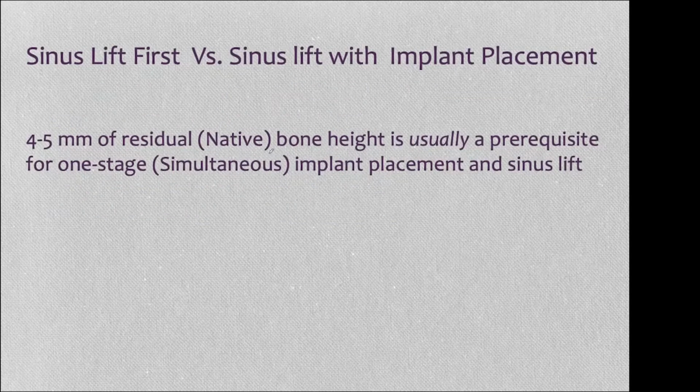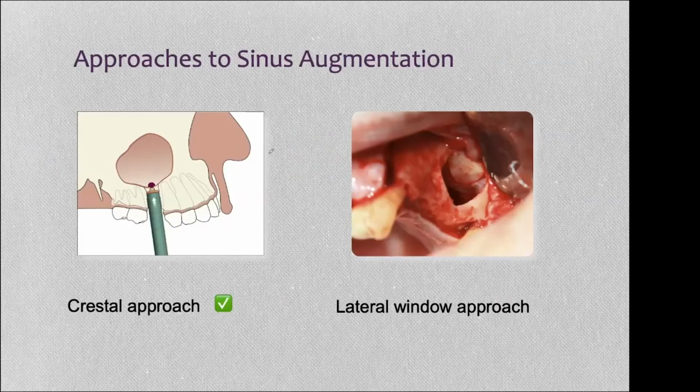So when do you do a sinus lift separately first, i.e. a lateral lift? And when do you do both? Now, if you use Bicon ultra short implants and you've been to any of our courses, you know that we try to do the immediate or simultaneous implant placement for virtually every case. That's been my mission, to eliminate the need for a lateral or sinus lift first. Okay, so our goal today is to expand on the crestal approach.